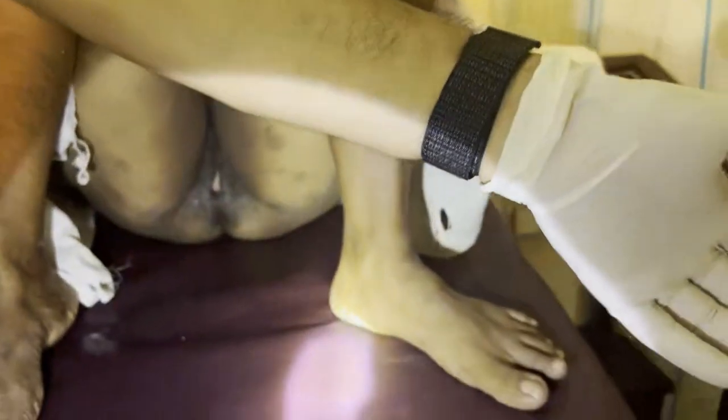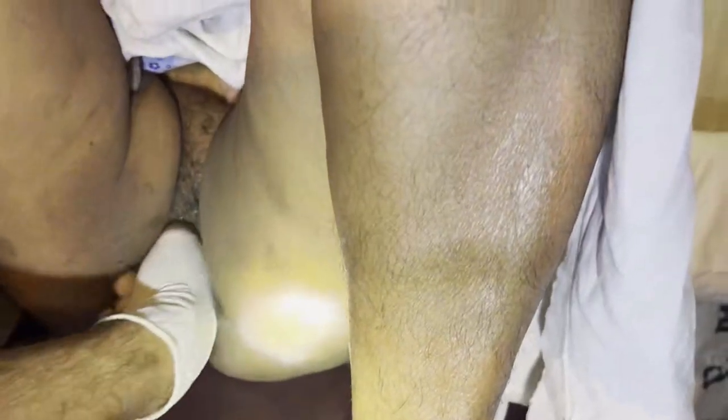Now we are going to do a bimanual vaginal examination. I would use one hand to examine vaginally and the other hand from the abdomen. I remove the drape, with one hand on the abdomen and the other hand in the vagina.